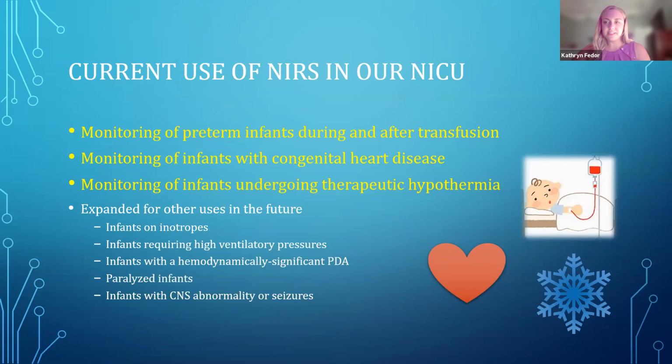And then recently, a few years ago, we began monitoring preterm infants before, during, and after PRBC transfusion. This program ended up being quite detailed, and the way it was rolled out really helped our nurses to understand NIRS a little bit better, with some really inclusive flow sheets and lots of education. So I'll be focusing on ways you can engage your team in learning about NIRS and get them excited, because it is a vast area of knowledge.